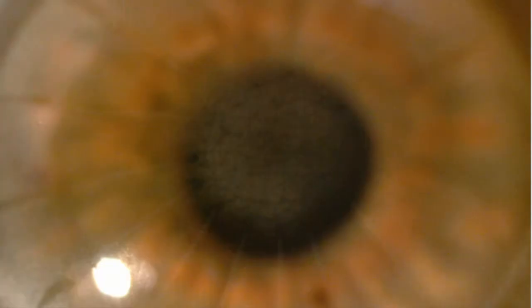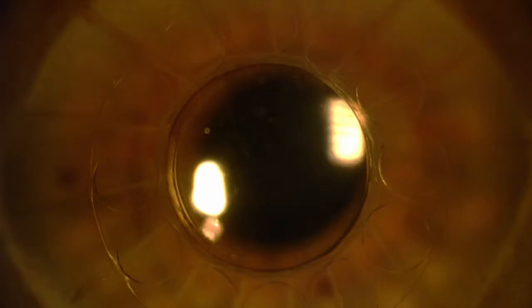Here we see a patient with a central corneal dystrophy and a patient with radial keratotomy. Note how much clearer the central cornea is after Caraclear XT surgery.